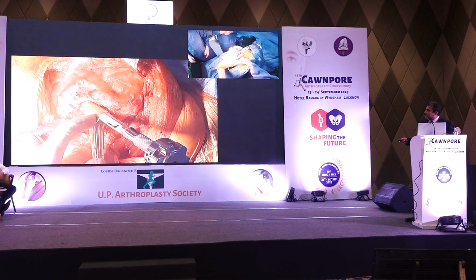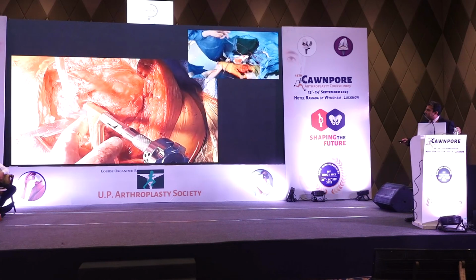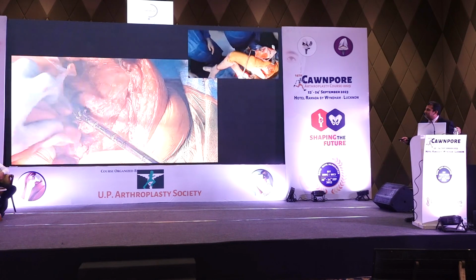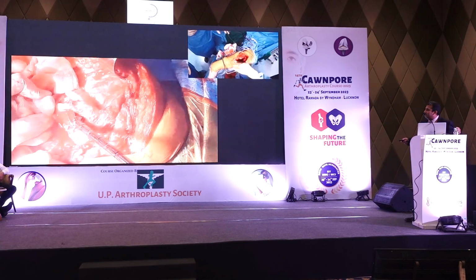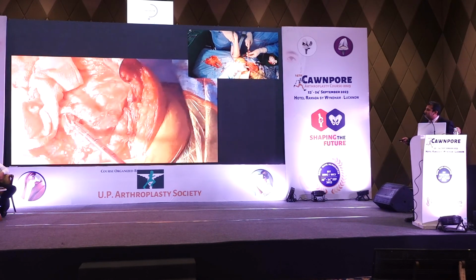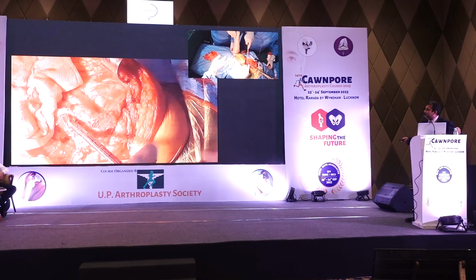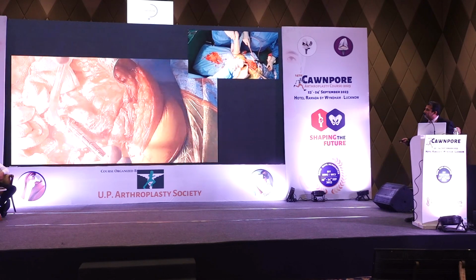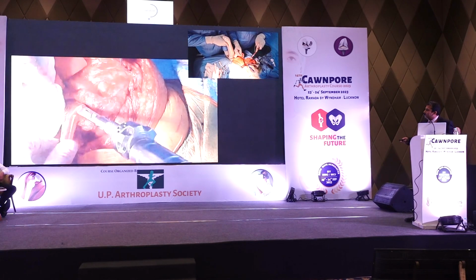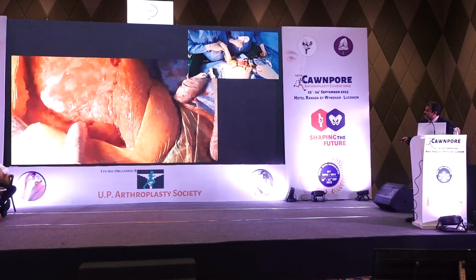And once I had done the trial, I found that as I'm trying to hammer it inside gradually, it's not going. I was expecting there would be leg lengthening. So I did more reaming, and I'm trying to put the stem further distally inside so that I can do some shortening, or approximate the length on both sides. This is also done manually. And then you can see I'm again doing a trial here in the desired anteversion, and I've done the reduction. So this is the trial reduction which is being done.